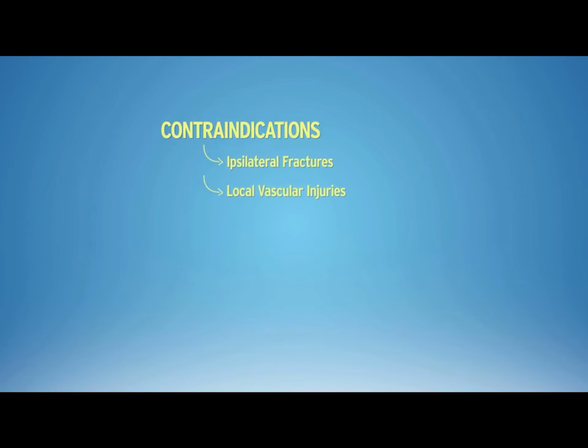Contraindications. The contraindications include ipsilateral fractures, local vascular injuries, cellulitis, burns, also previous attempts of ipsilateral intraosseous access.